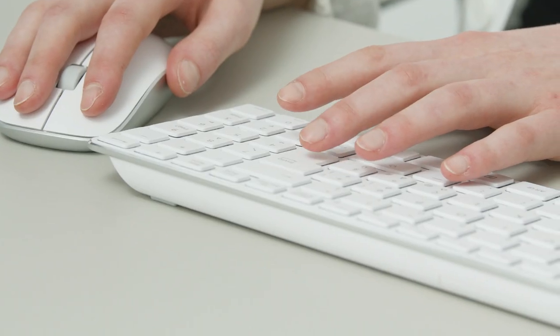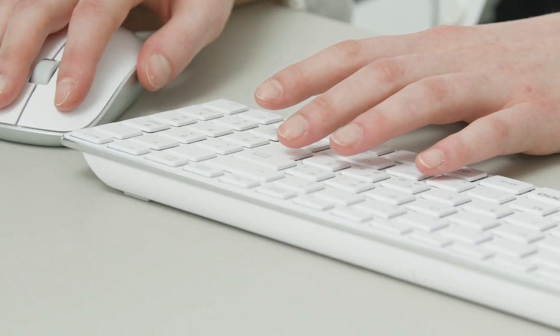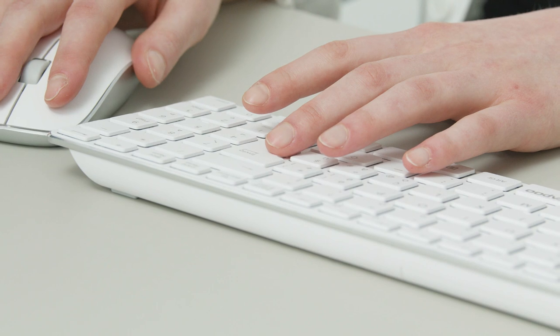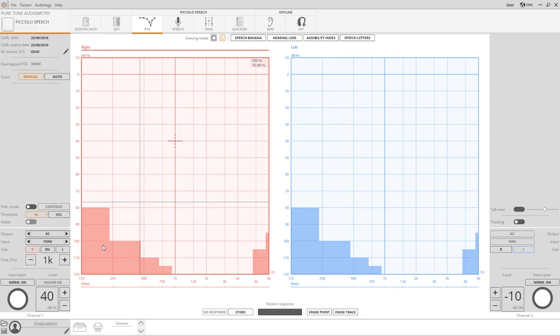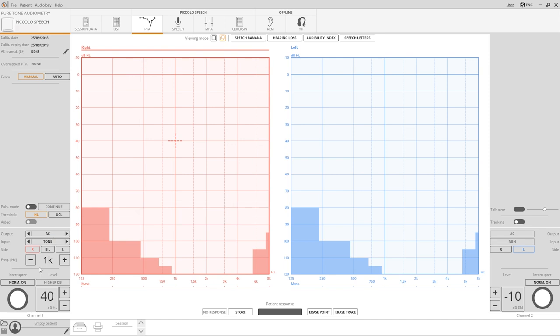The user can control the software using either a mouse or the computer keyboard. On the lower part of the two columns there are controls corresponding to the two channels. The left column is the primary stimulus channel and the right is for the masking.